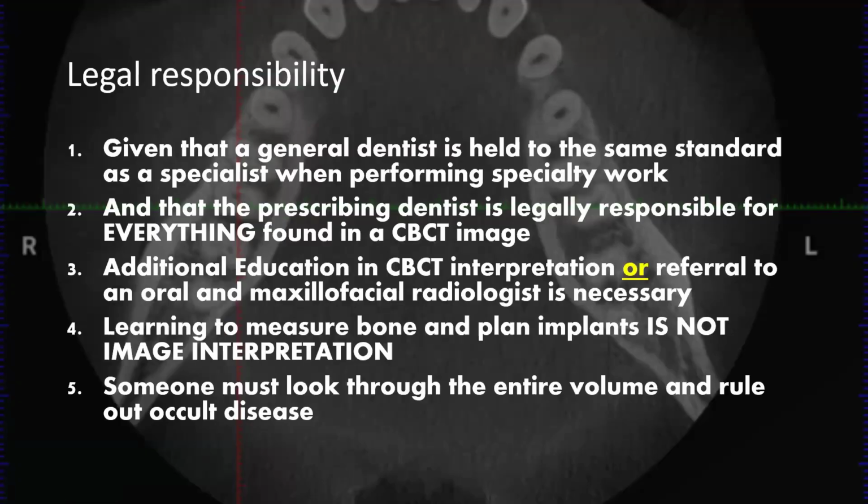All right, we've talked basically about these points when I did your legal lecture. You're responsible for everything found in a CBCT. That means if you're going to be using these, do get more education. Reach out to someone like me, reach out to a radiologist in your area, someone that can interpret. I would say just don't ignore. I think it's way too common to be happy with ignoring anything outside of the field of view, and things that could potentially affect the patient's health.